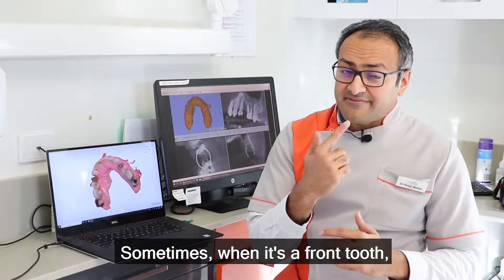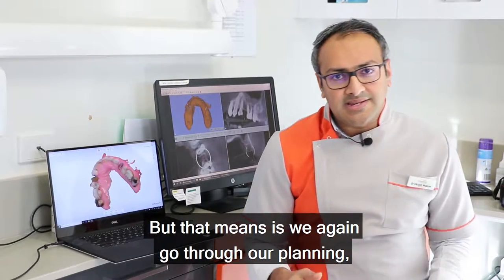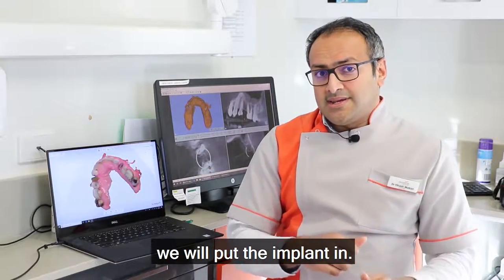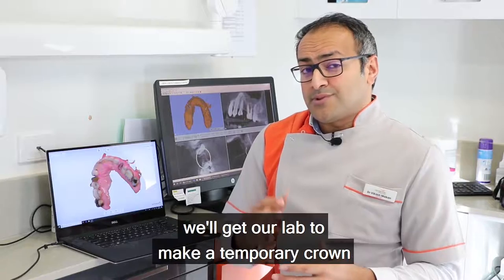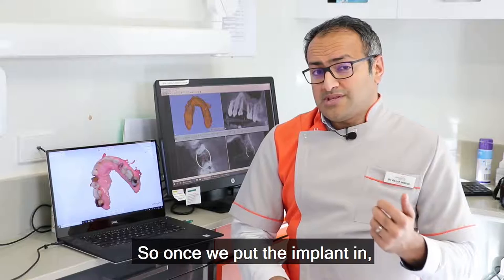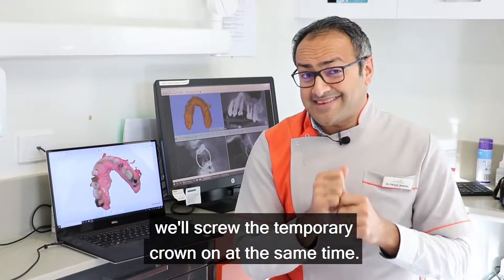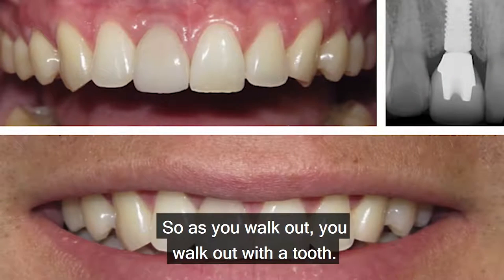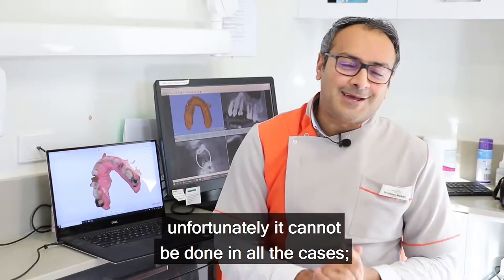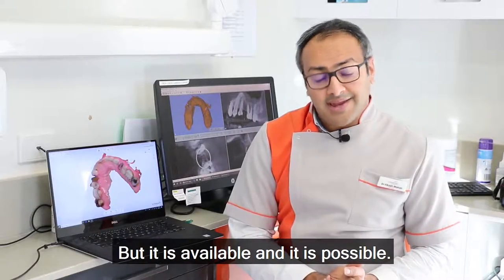Sometimes, when it's a front tooth, we are able to do an immediate implant. We go through our planning and put the implant in. Before we place it, we get our lab to make a temporary crown which is already ready. So once we put the implant in, we screw the temporary crown on at the same time — as you walk out, you walk out with a tooth. This same-day dentistry unfortunately cannot be done in all cases, but it is available and it is possible.